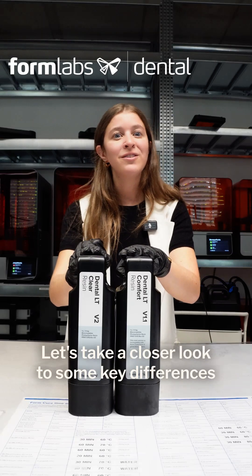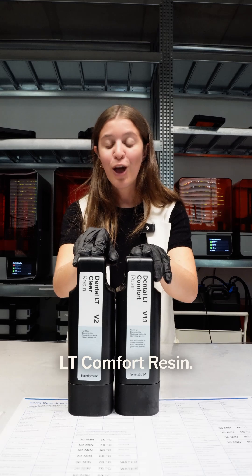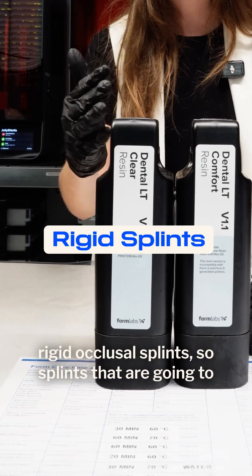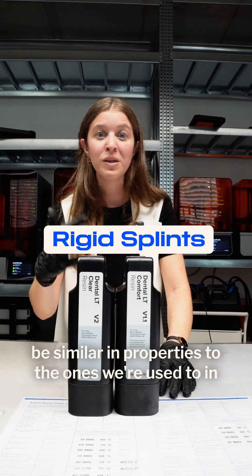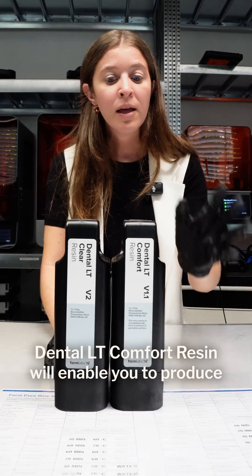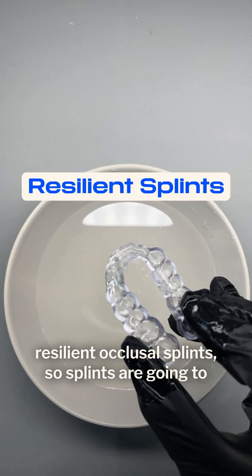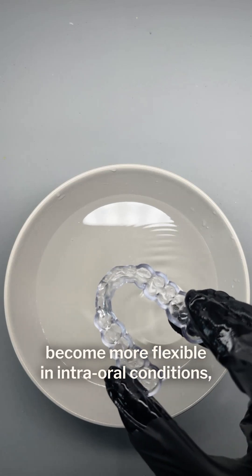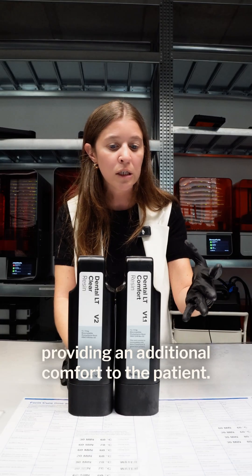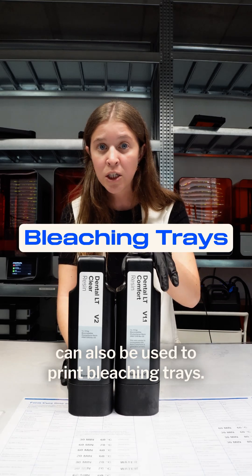Let's take a closer look at some key differences between Dental LT Clear Version 2 and Dental LT Comfort Resin. First, Dental LT Clear Version 2 can be used to produce rigid occlusal splints — splints that are going to have similar properties to the ones we're used to in the traditional workflow. Dental LT Comfort Resin will enable you to produce resilient occlusal splints, so splints that become more flexible under intraoral conditions, providing additional comfort to the patient. An additional note is that this material can also be used to print bleaching trays.